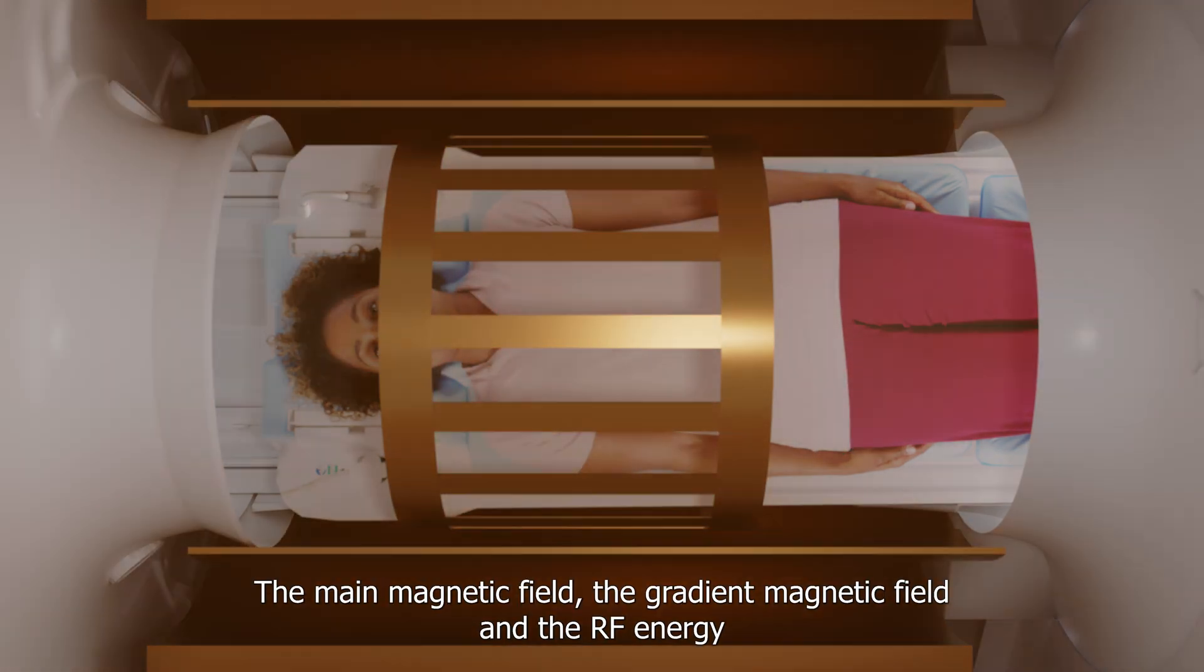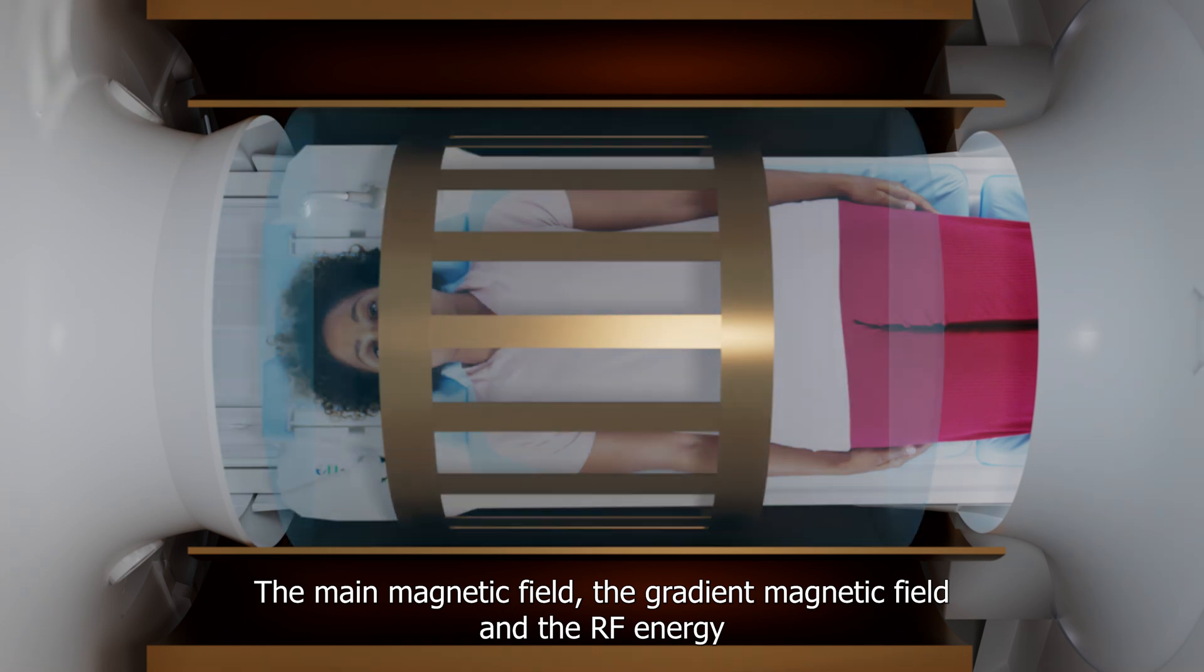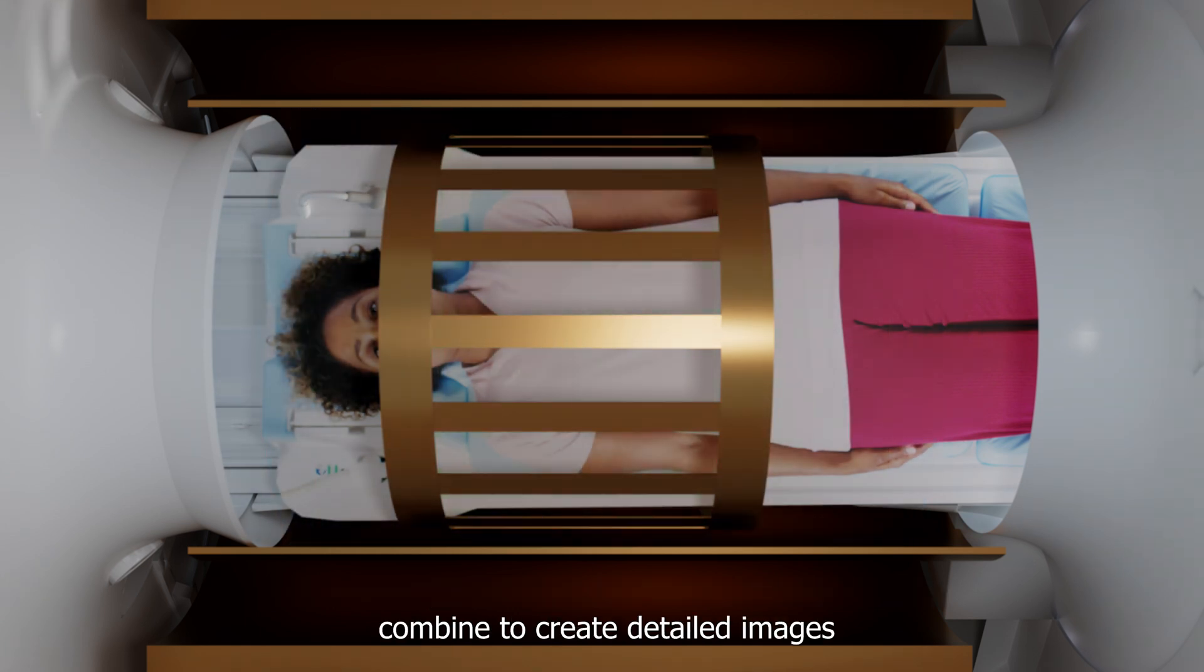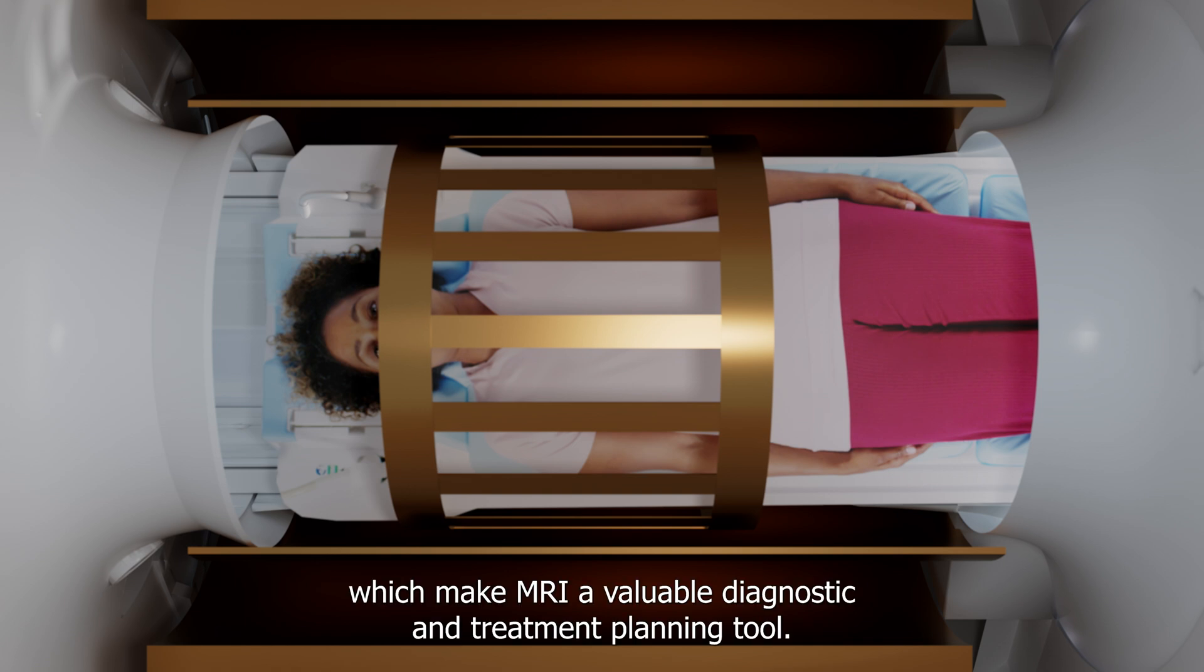The main magnetic field, the gradient magnetic field, and the RF energy combine to create detailed images, which make MRI a valuable diagnostic and treatment planning tool.